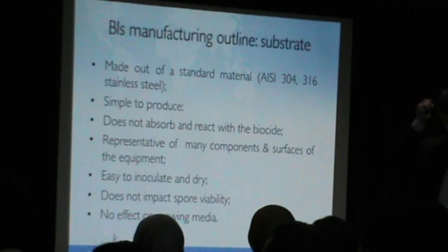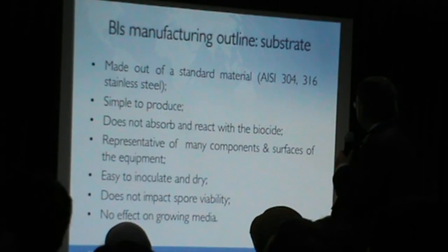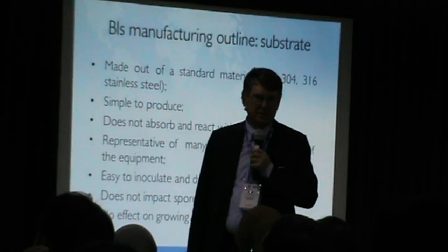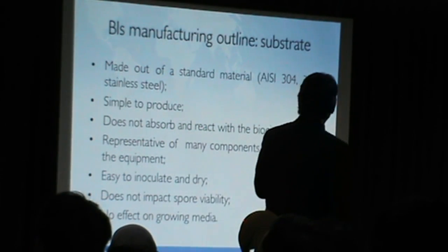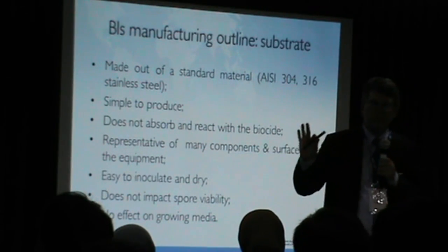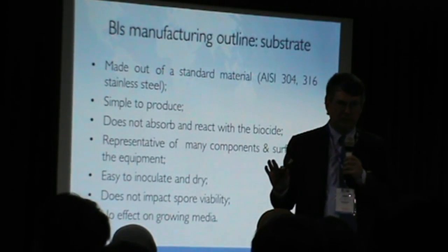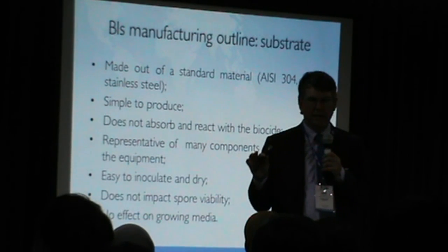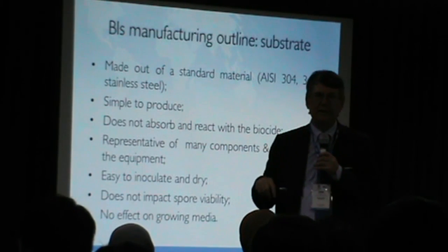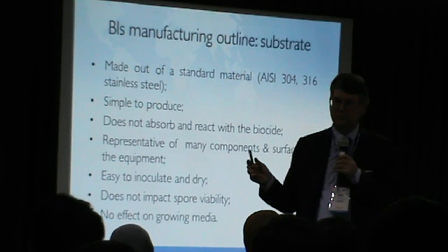So how are they made? The BIs are generally made of a standard substrate of stainless steel 304 or 316. So we are talking of the BI dedicated for surface decontamination, because if we are talking of the BI dedicated for steam sterilization, they can have other different substrates.